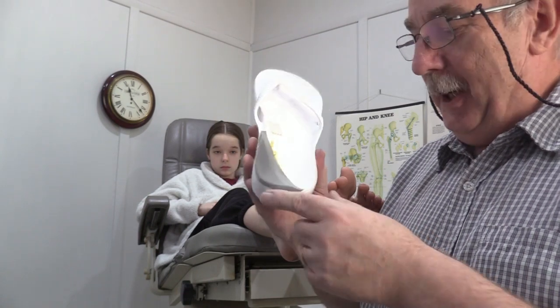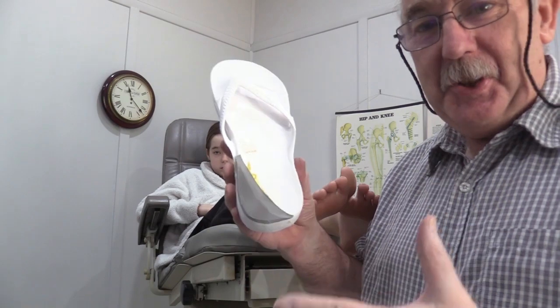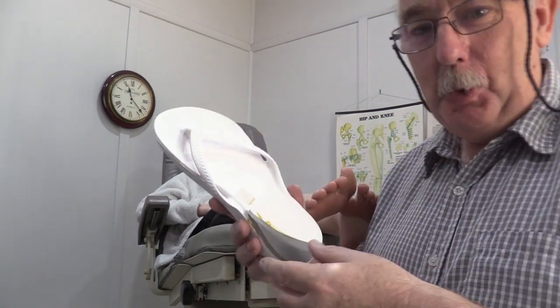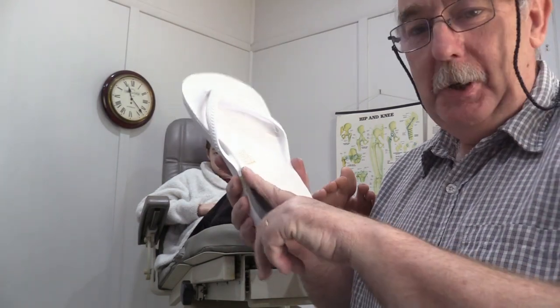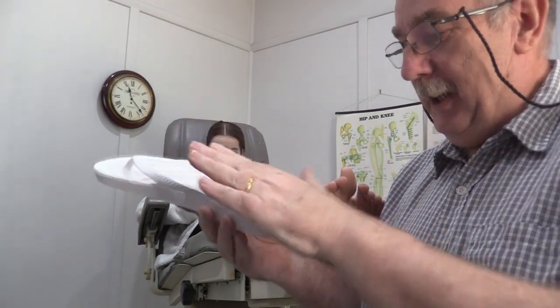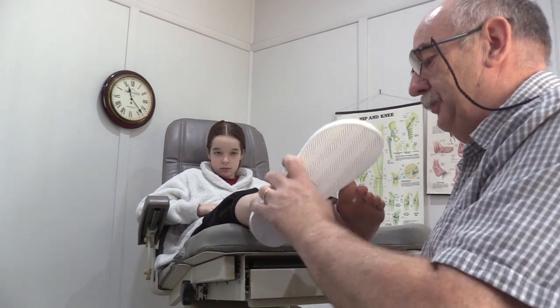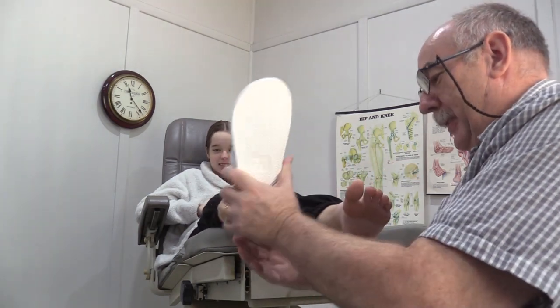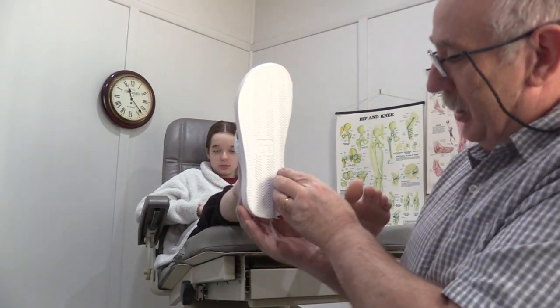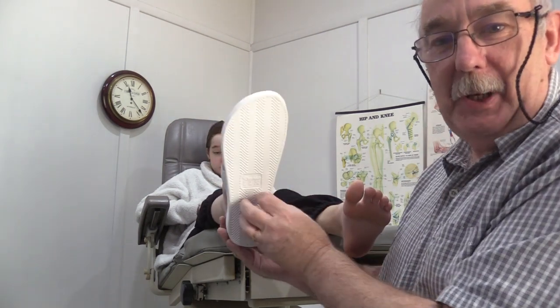So you can see what I've done here. I've done it in grey because I want you to be able to see it — if I was doing this for a patient I'd use a white EVA. Archie's come in a whole range of different colors, so we have a whole lot of different EVA colors to match. You can see how I've ground and smoothed off that edge. Steffi wearing this — you can't actually see from behind, but you can see what's happening is we've got an extra force or load on the medial side of that subtalar joint axis.